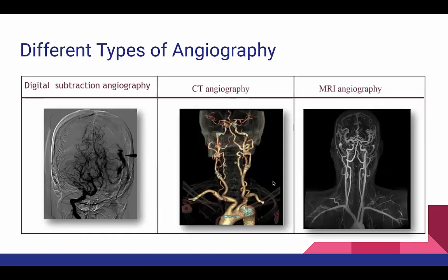Here there are different pictures of the angiography procedures using different approaches. At the left, you see digital subtraction angiography. You may wonder why conventional angiography is now named digital subtraction angiography. We're going to be covering that. We're going to be covering what digital subtraction means and also what the conventional is actually. So, yes.